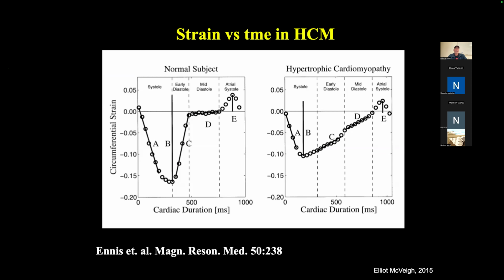And in fact, we had a magnet at the NIH that was a short experimental magnet that's no longer on sale, but I love that thing. And it was a 1.5 Tesla magnet, really short. And they had a special keyboard that you could bring in the room because we were going to use it for interventional stuff. But I could run experiments on myself and control the scanner, like lie on the scanner table and enter new parameters and take a picture and enter new parameters, take a picture, which was really great.